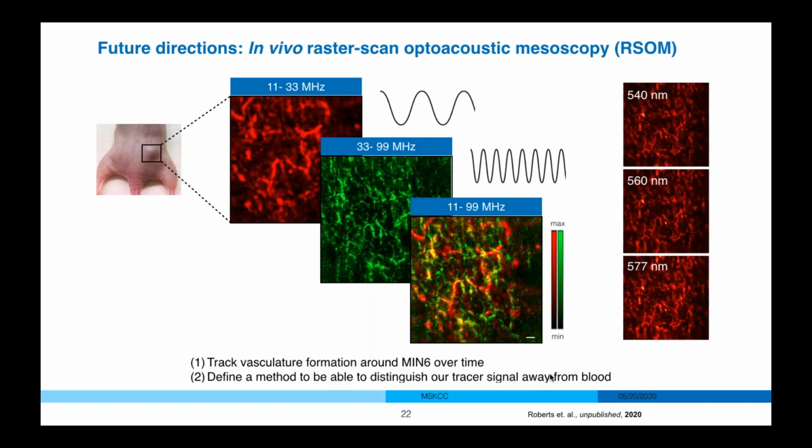Those are the challenges that I'm currently investigating. Future work that could be included in these studies are 3D optoacoustic tomographic systems, which could work in favor of the near-infrared absorbers. Handheld systems are also known to provide quantitative assessments with greater sensitivity than 2D systems, which could be up for discussion in this seminar. And with that, I just want to conclude my work.